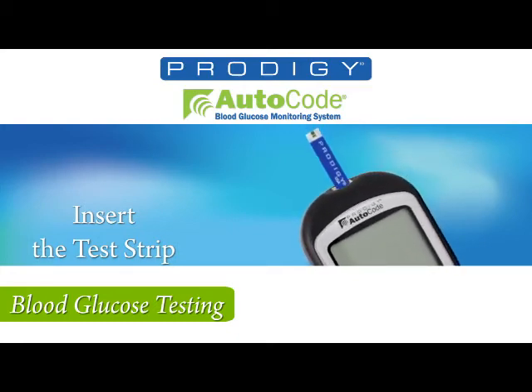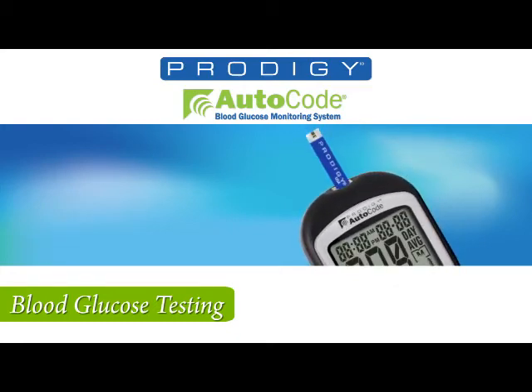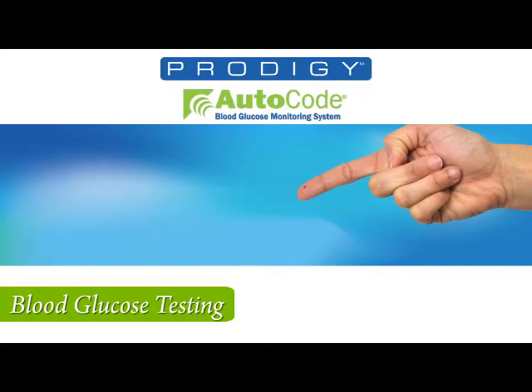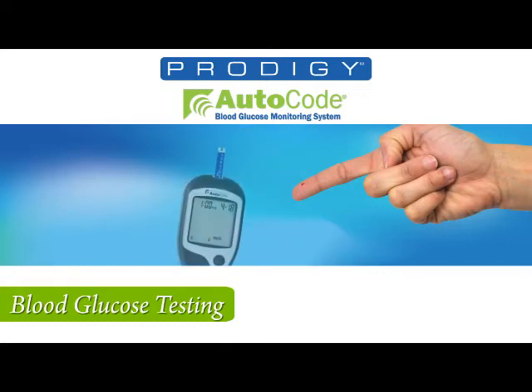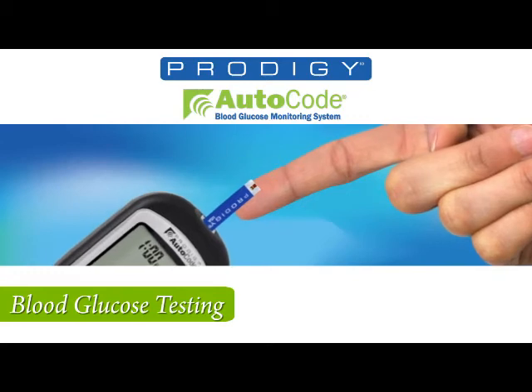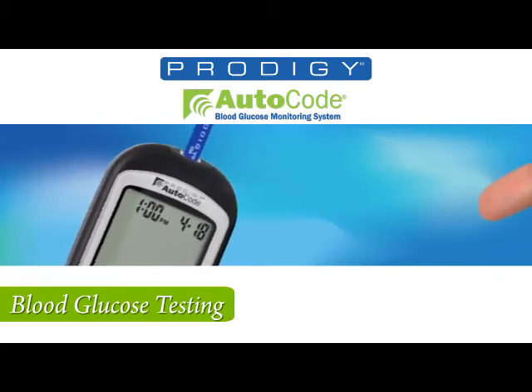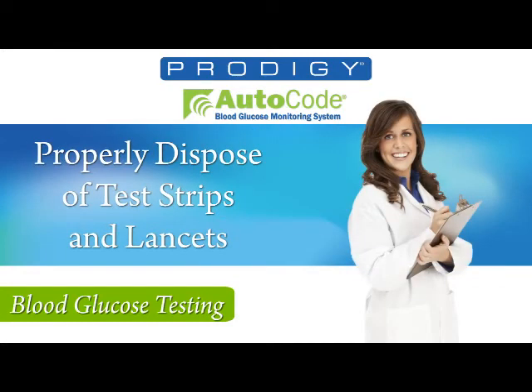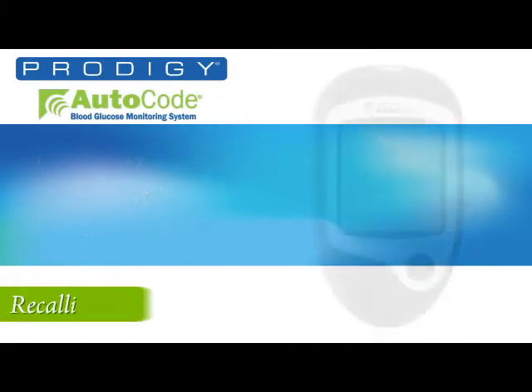Insert the test strip into the test strip slot. Puncture finger with lancing device. Wipe off the first drop and apply the second drop to the test strip. When the absorbent opening is full, the meter will beep. Your meter will now count down from 6 to 1 and show the result. Discard the test strip and lancet according to local regulations.